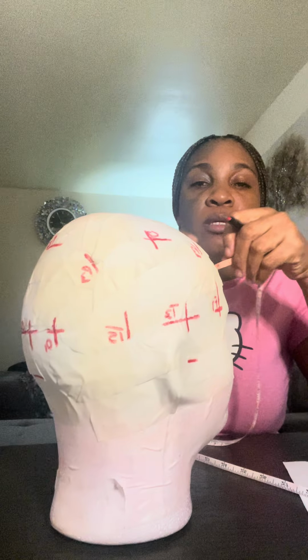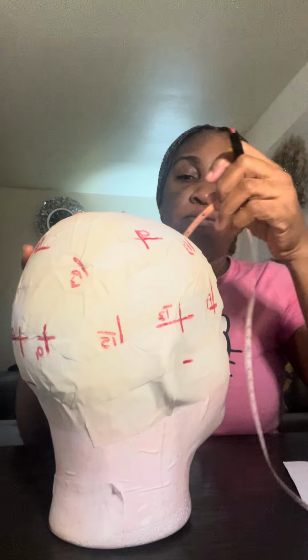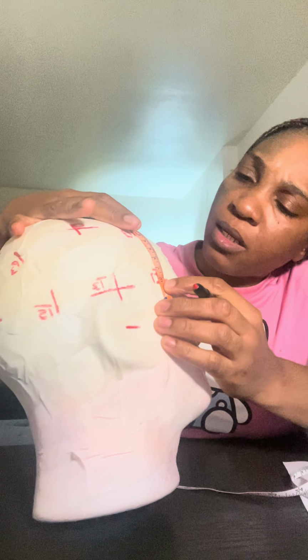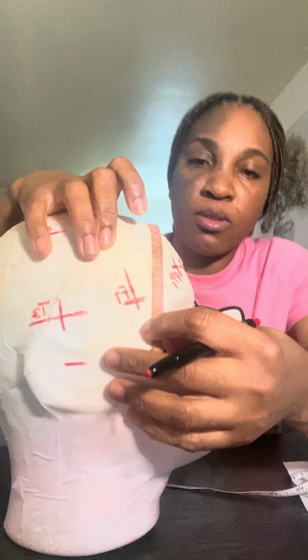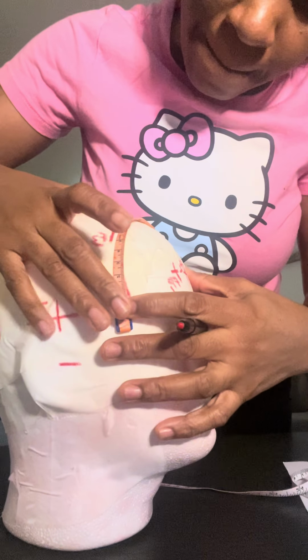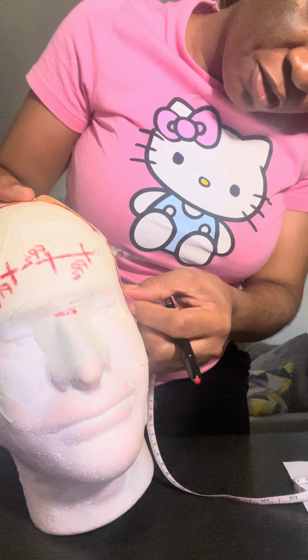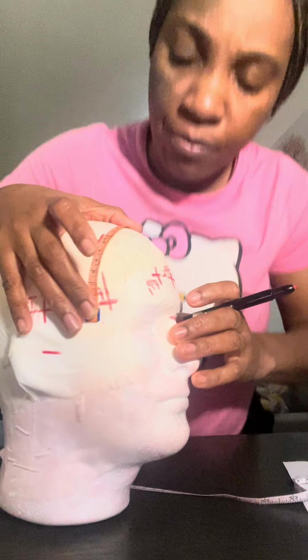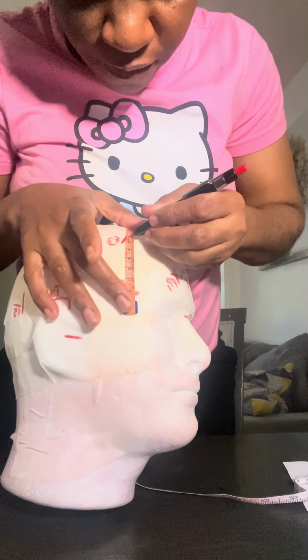So I'm going to take my anterior measurement, putting my tape on F7 on 0 mark, going through my FZ down to F8. Okay, this gave me 22. So 22 divided by 4 is 5.5. So my 0 tape on F7, 5.5.